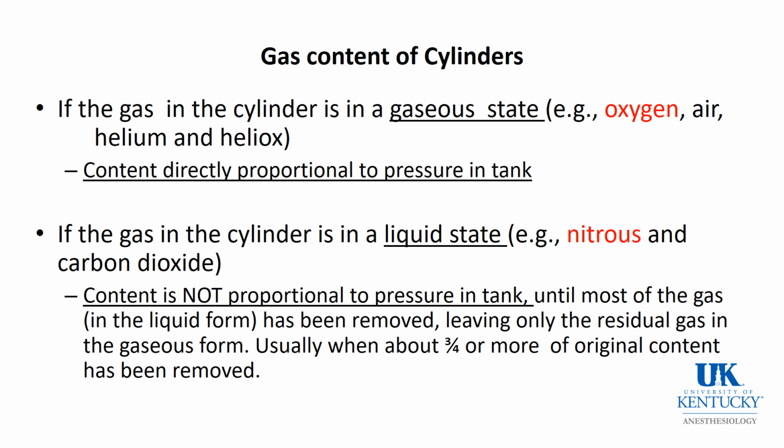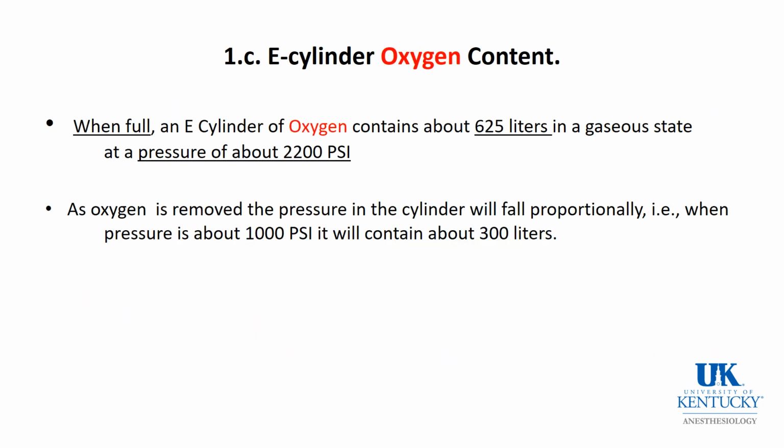In other words, all the liquid is removed. And for nitrous, about 3/4 of the volume has to be removed before all of the liquid is now in the gas phase.